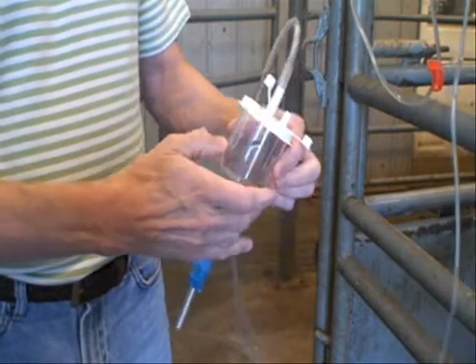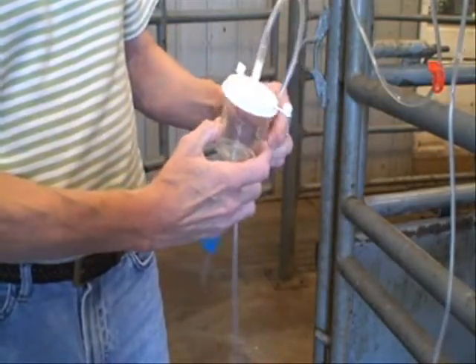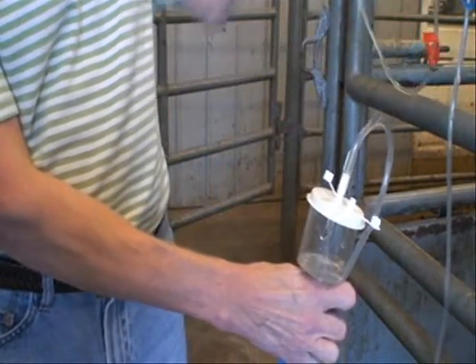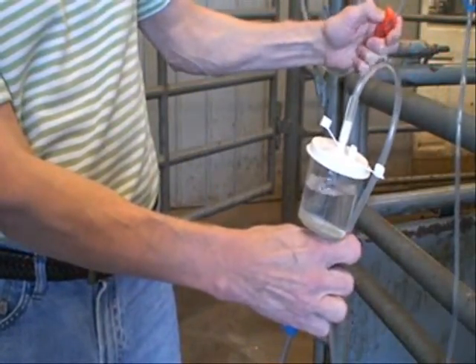We want to fill the filter about halfway full of liquid. Close the bottom clamp as it is — this one is open, the vent should be open. Open your Y tubing to allow fluid from the bag up above to come down the tubing, entering into the cup until the cup is about half full of flush media.